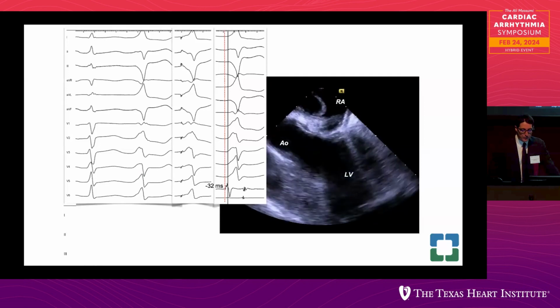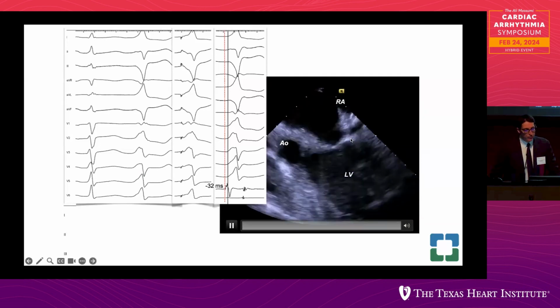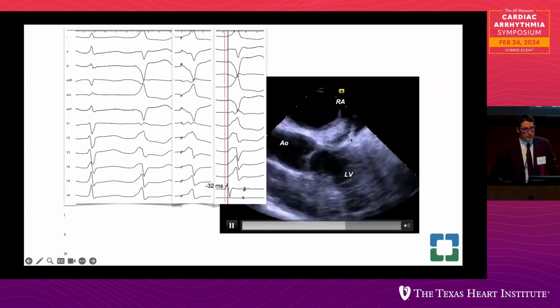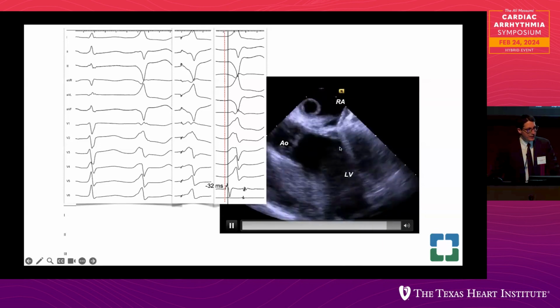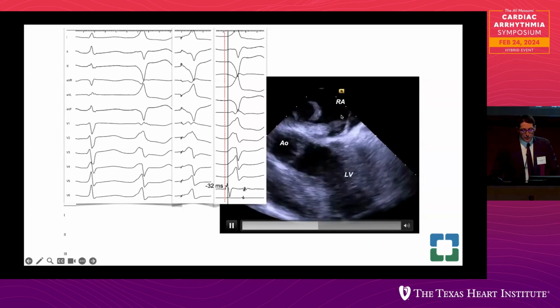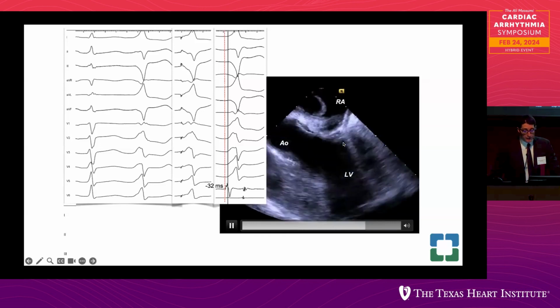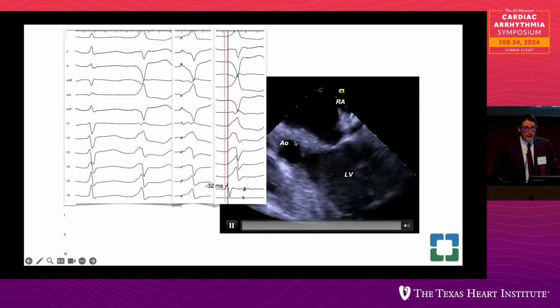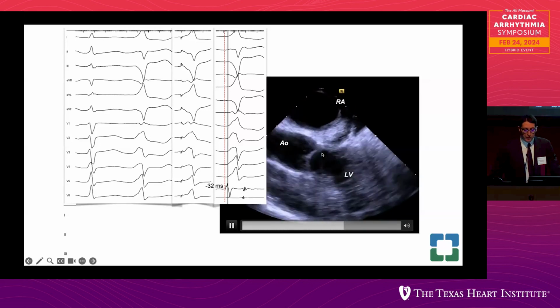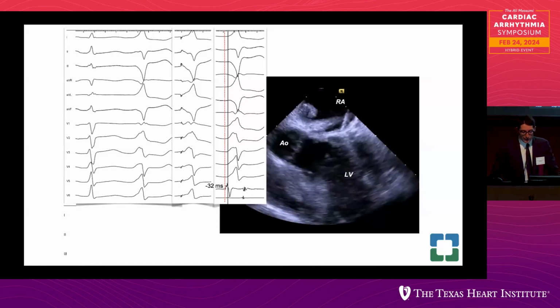There's just another example here. You can see the catheter is deployed within the right atrium and is touching directly the posterior aspect of the septum of the left ventricle. And again, this area is the same one that we target for some pathways that insert from the right atrium through the left ventricle. Some PVCs and some VTs can be eliminated from here, but also you can use it as an access site for a patient with dual mechanical valves, from the right atrium to the left ventricle, in the aortic and mitral position, because again, this is an area that you can chase and target for that.